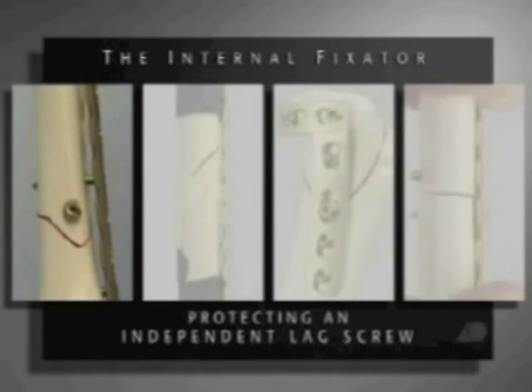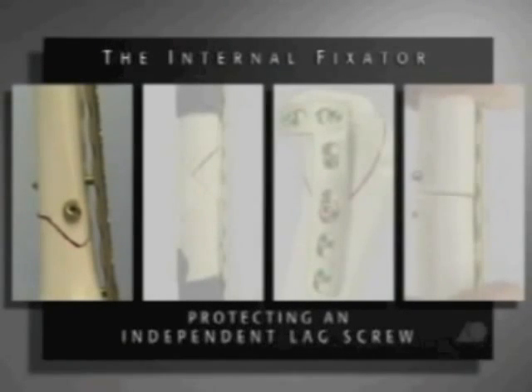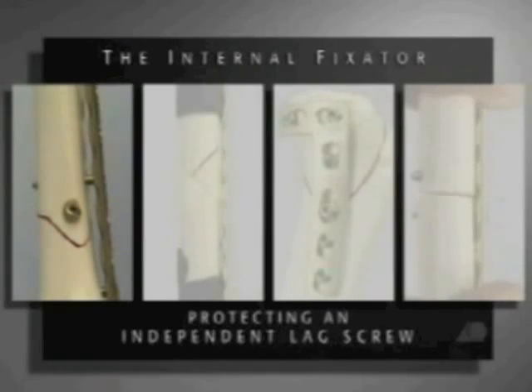First, the internal fixator, protecting an independent lag screw which provides absolute stability.